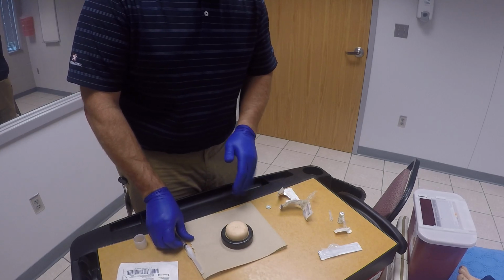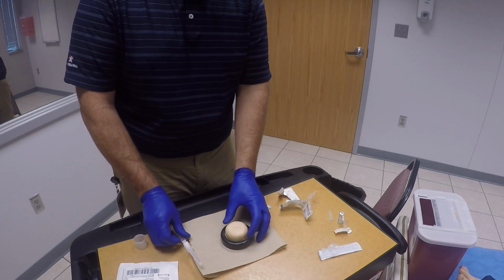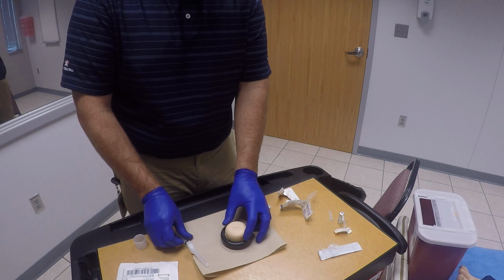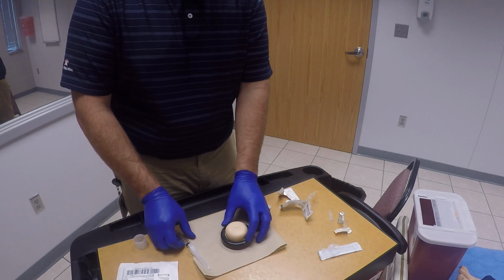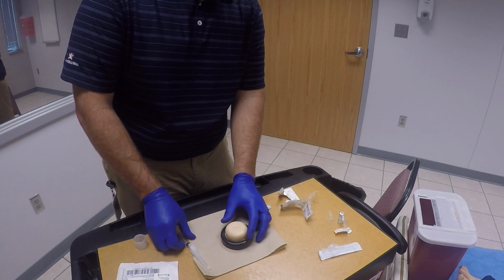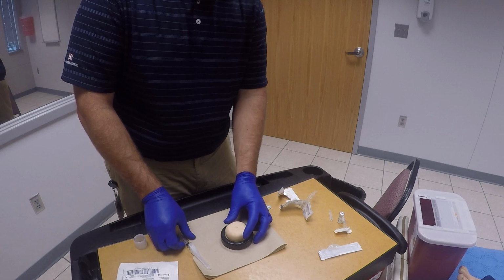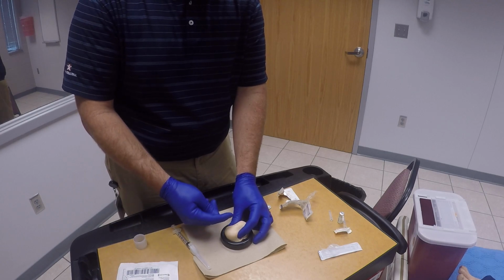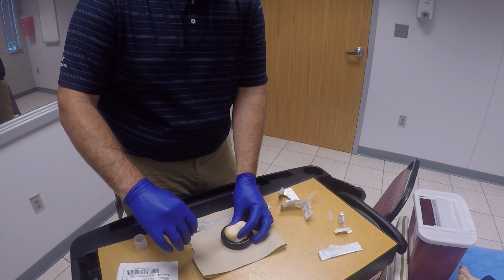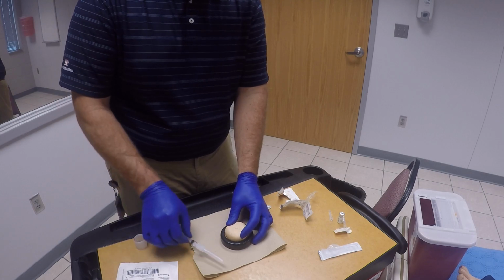Okay, we've of course already checked that we do have our PPE on. We want to make sure that we have a good site. If we're going to be giving IM, we want to have a good muscle, whether we're using it up in the arm in the deltoid or the gluteus maximus, wherever we're giving it. If we're using a sub-Q area, we'll go ahead and pinch the skin, and then the medication will go directly underneath the skin at a very low angle. But since we're doing IM, we're actually going to kind of stretch the skin just a little bit there.